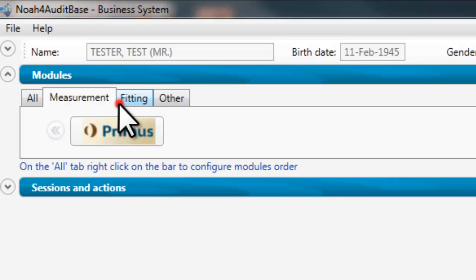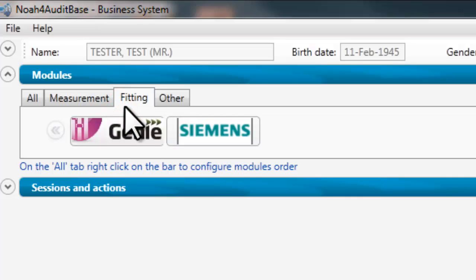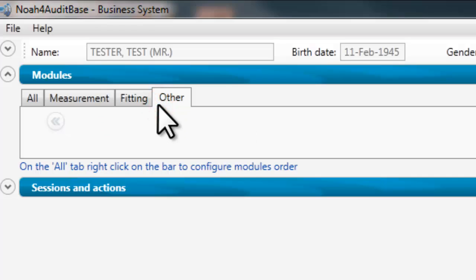Fitting shows the fitting modules, and Other shows any modules not fitting into the other categories.